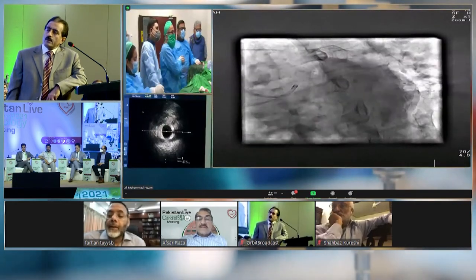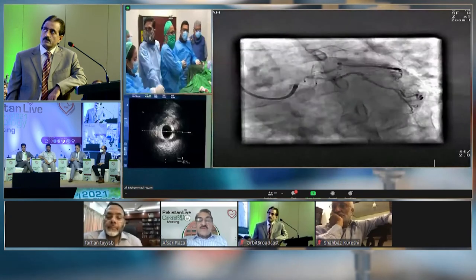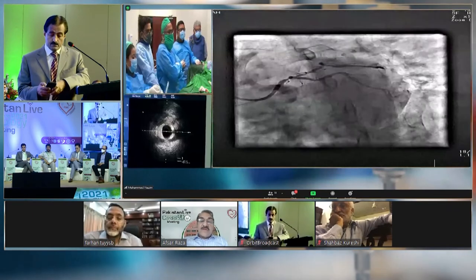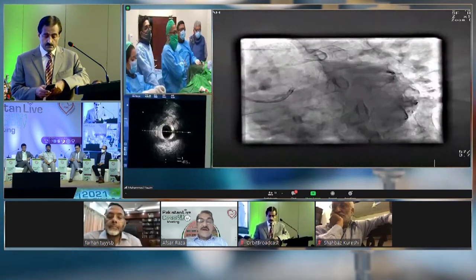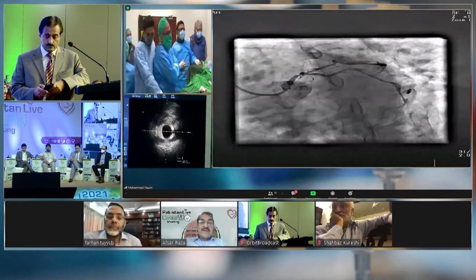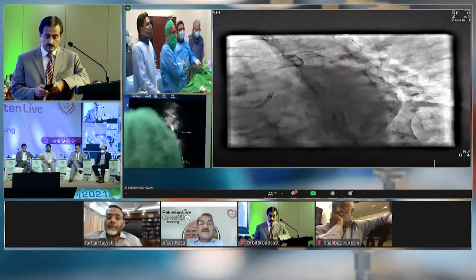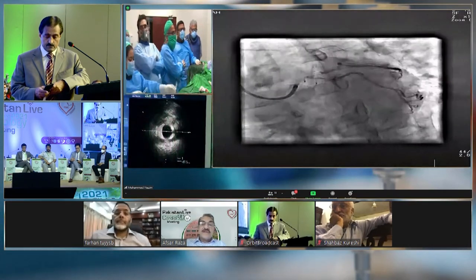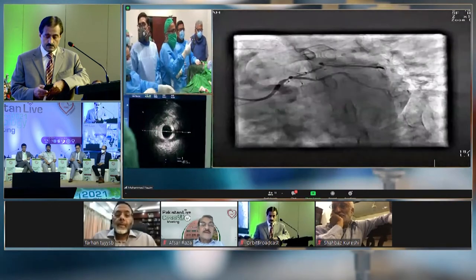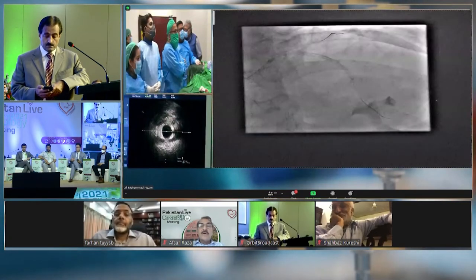Yes, I think this gentleman has a very tight distal left main, possibly involving the ostia of both the LAD and circumflex. The circumflex appears occluded because it is now wired, but the main thing we can see is the distal stenosis in the left main stem, which is quite critical. I don't know if we can see the other views to see if there is any calcification in the left system. Yes, there is calcification quite visible. Next view, cranial.